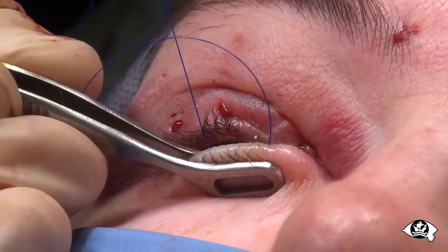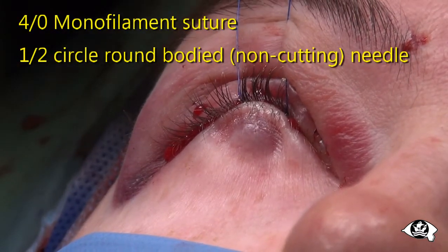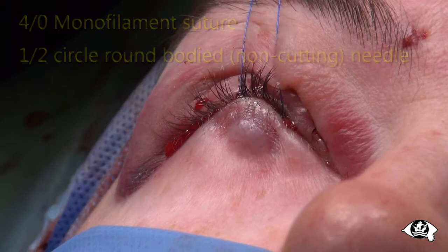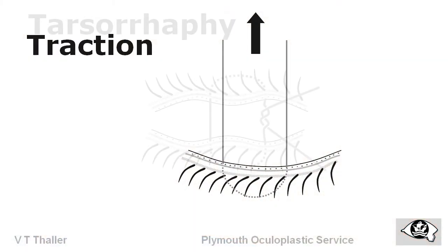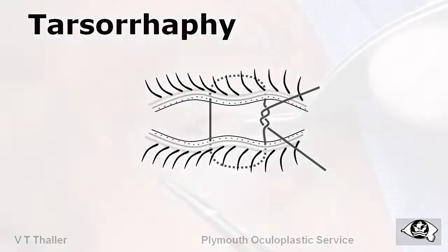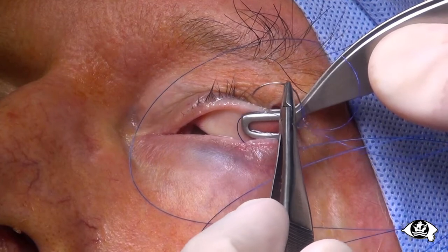Advance the needle tip until it again exits the lid margin. Should it not come out of the meibomian line, partially withdraw the needle and re-advance in a slightly better direction. With these new forceps, tarsal traction suture placement is as simple as that.